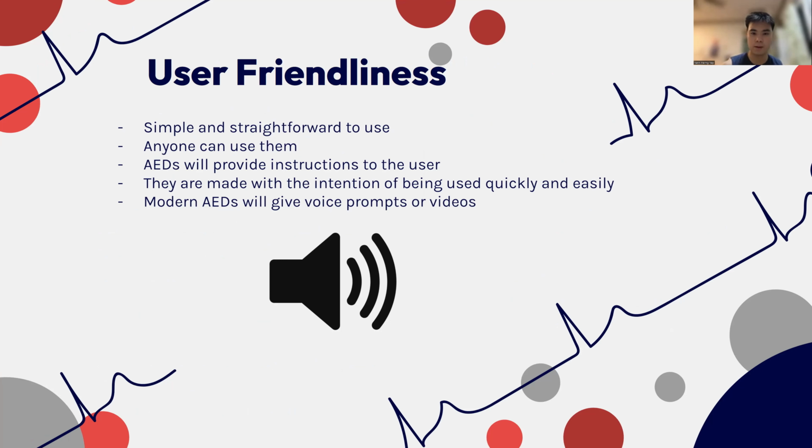There are also many myths surrounding them, one of which is the falsehood that they can only be used by trained professionals. Even though it is better to have training, it's not necessary because the device instructs you on what to do. And some defibrillators in hospital require training, but the AED is different because it's made with the intention of being used quickly and easily by the average person. And some modern AEDs, when you open them, will give you voice prompts, and they're made to be simple to use, and they help people under pressure relax.